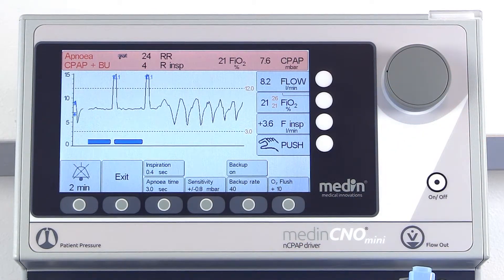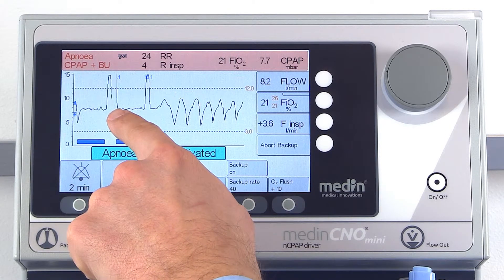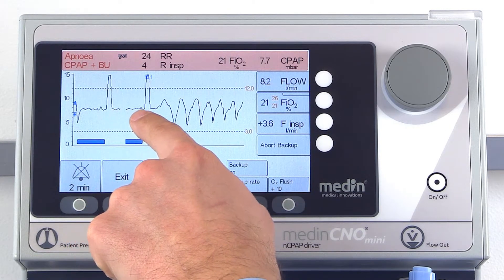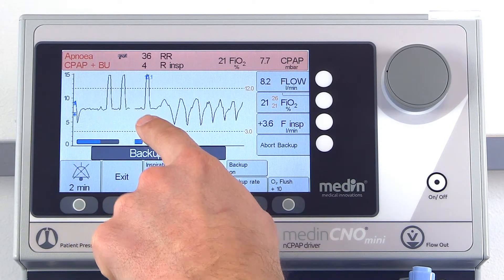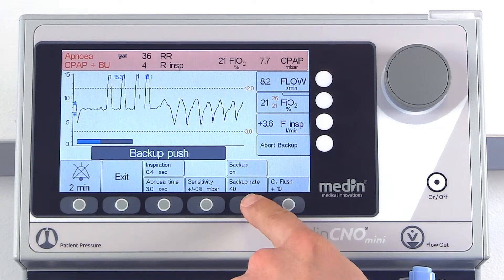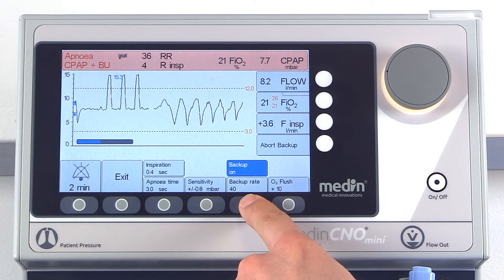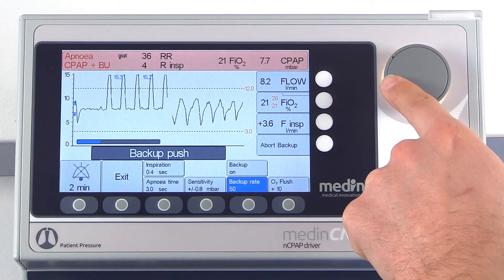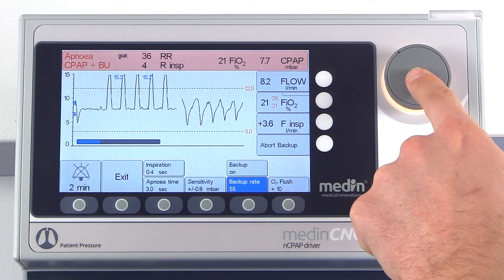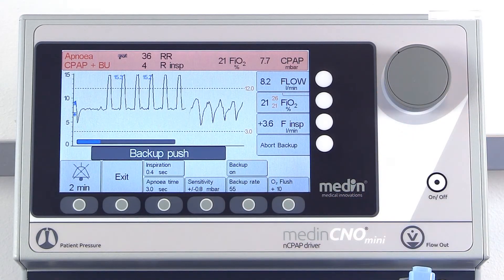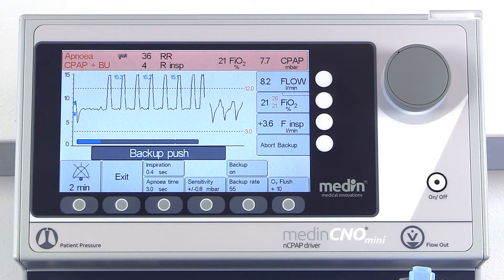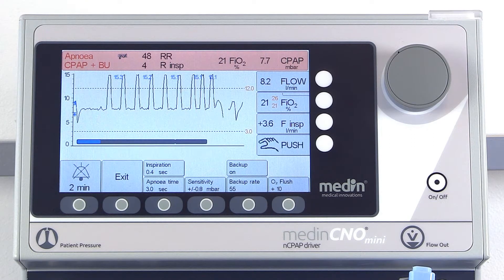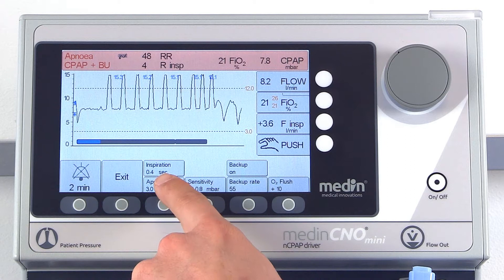The backup rate can range from anywhere between 10 and 120 breaths per minute. The rate for the backup depends on the selected inspiratory time.